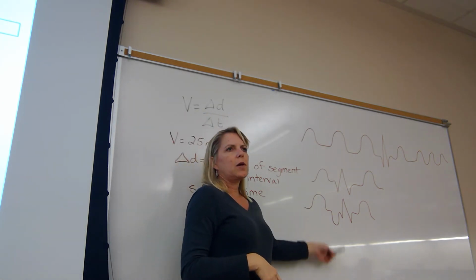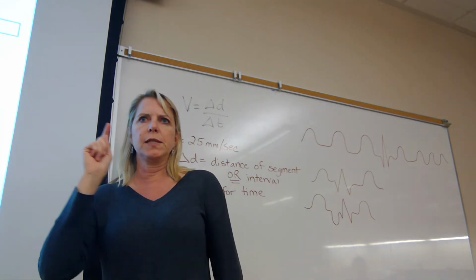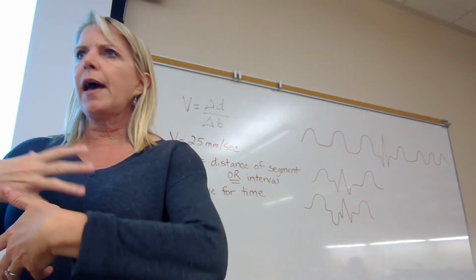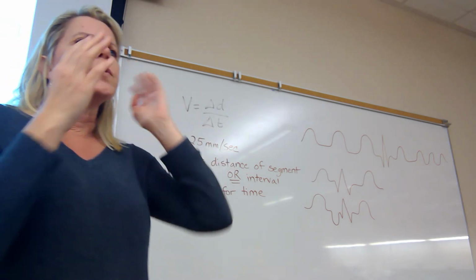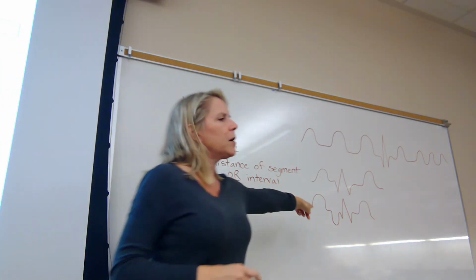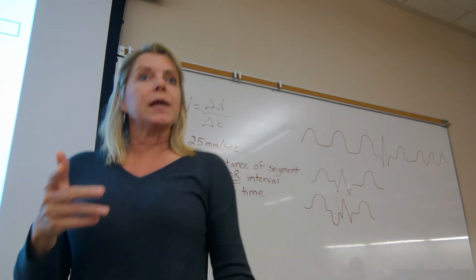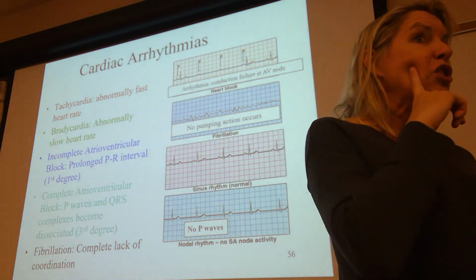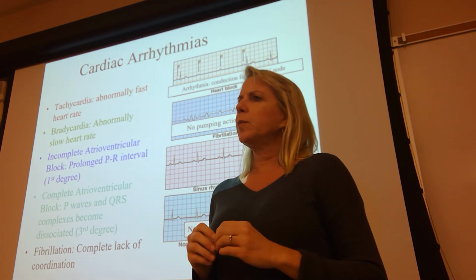And students say, well, Kara, if you're telling me that atrial repolarization does in fact occur, and it does, it has to. Atria have to repolarize to relax. If you're telling me it happens, Kara, why don't we see it on the EKG? And this is where I told you, if you take an EKG class and you ask that question, this is the answer they will give you.